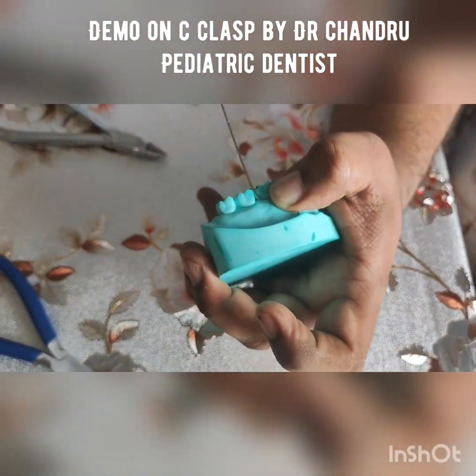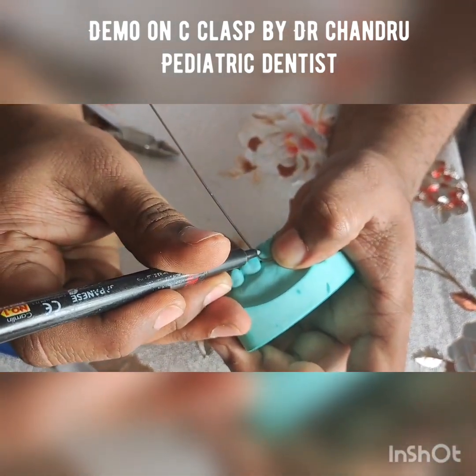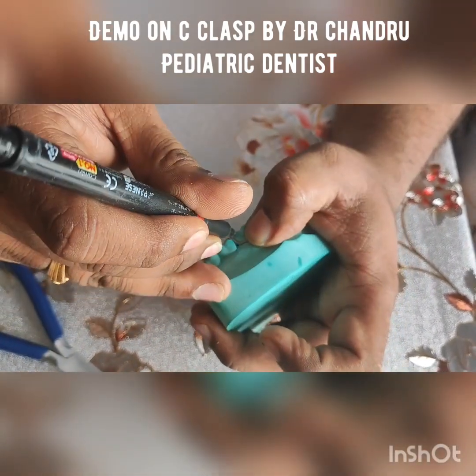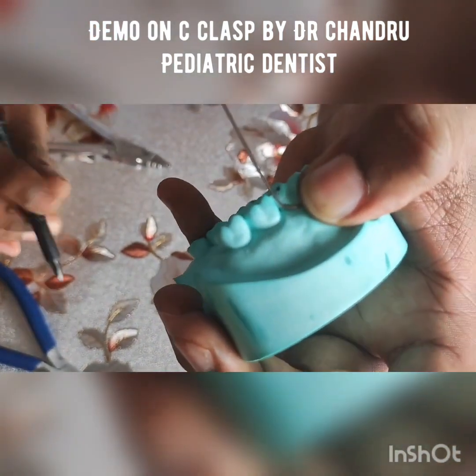Followed by this, from the point of contact to the occlusal surface, marking has to be done. So this marking has to be done.